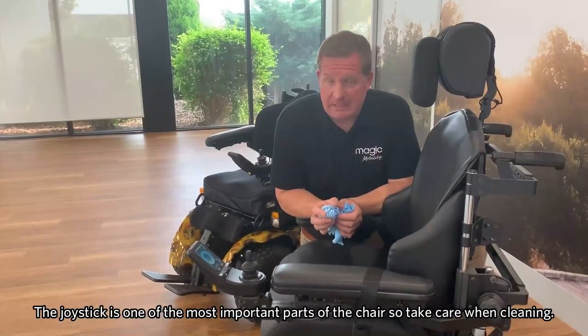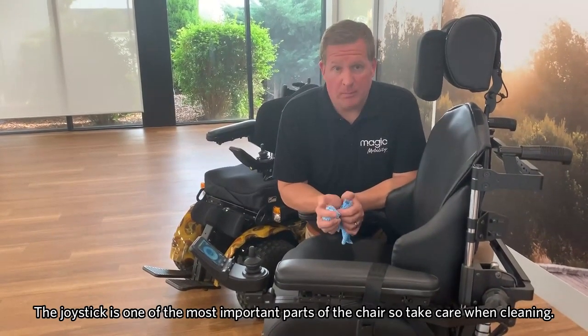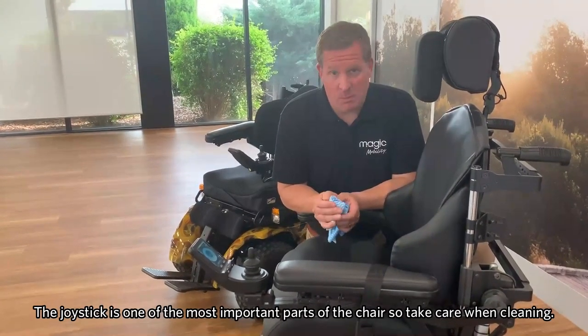Let's look at the joystick now and the cleaning of it. This is of course one of the more important parts of the chair, so we do have to take care when cleaning it.